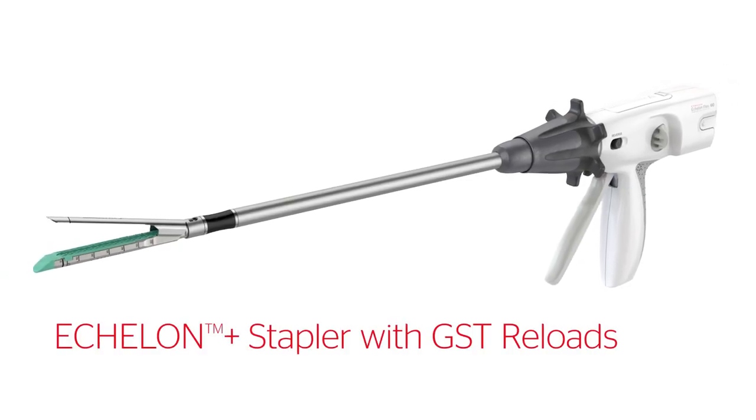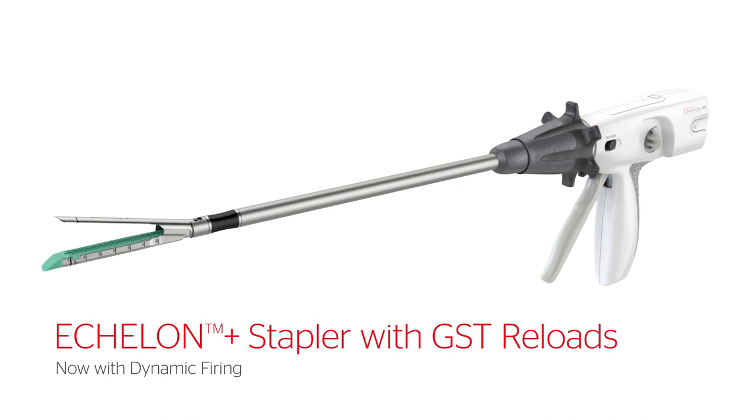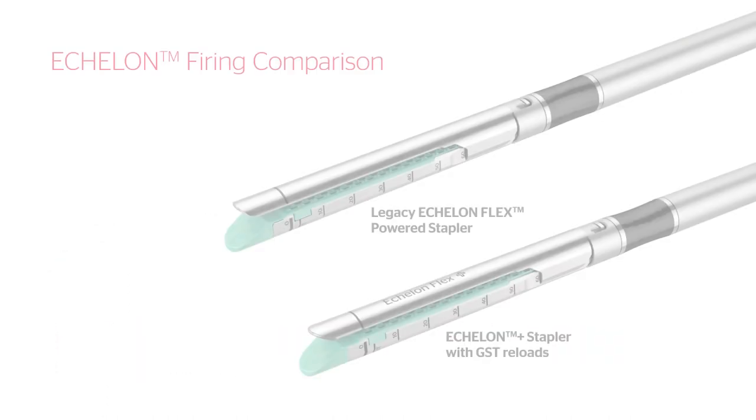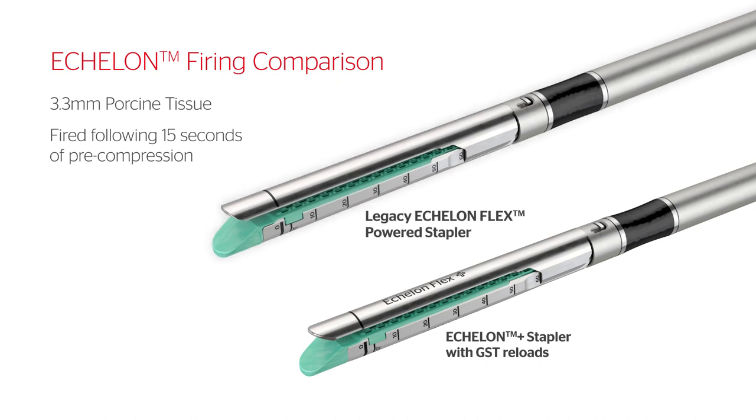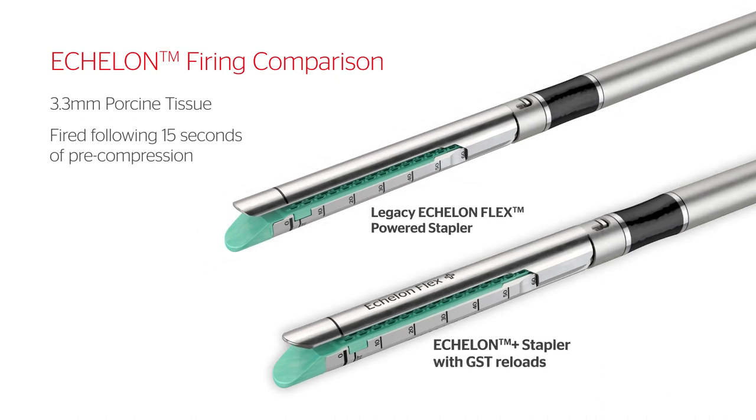Introducing the Echelon Plus stapler with GST reloads, now with dynamic firing for advanced security even in challenging conditions. This video compares the firing of the legacy Echelon Flex powered stapler with the dynamic firing of the Echelon Plus stapler with GST reloads.